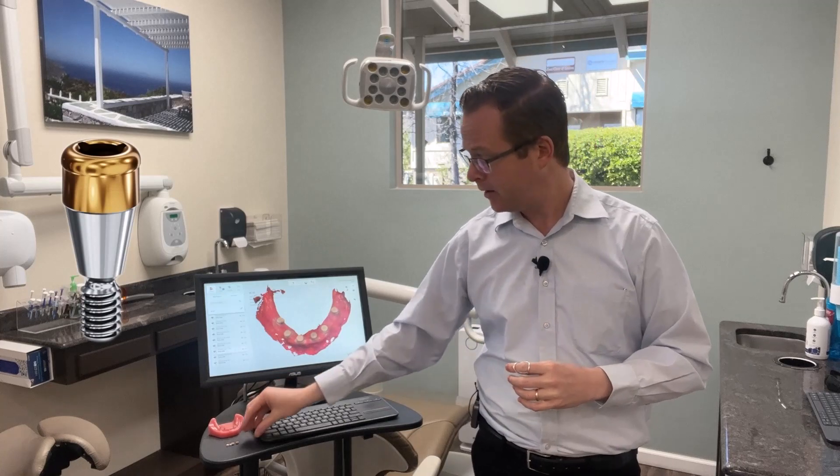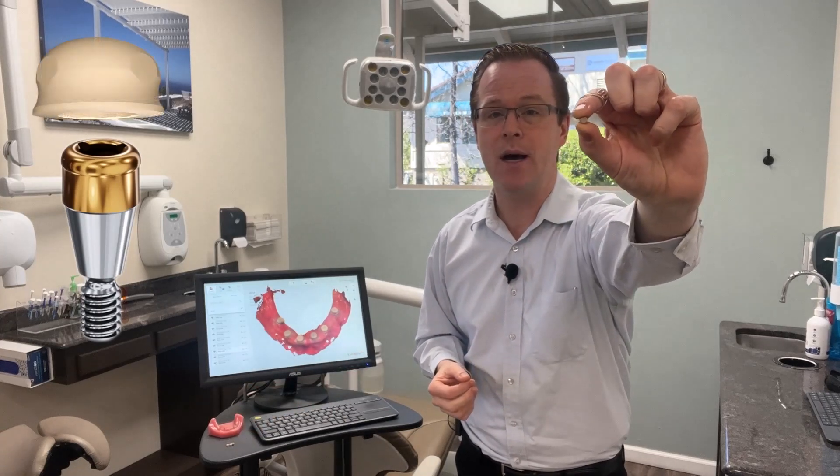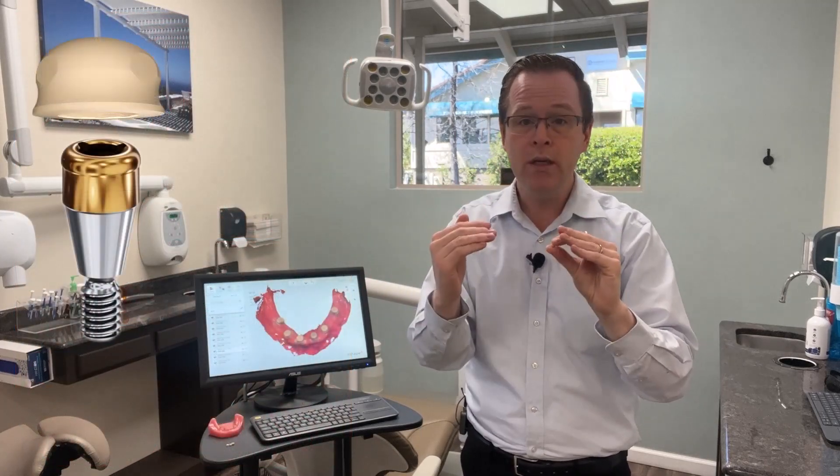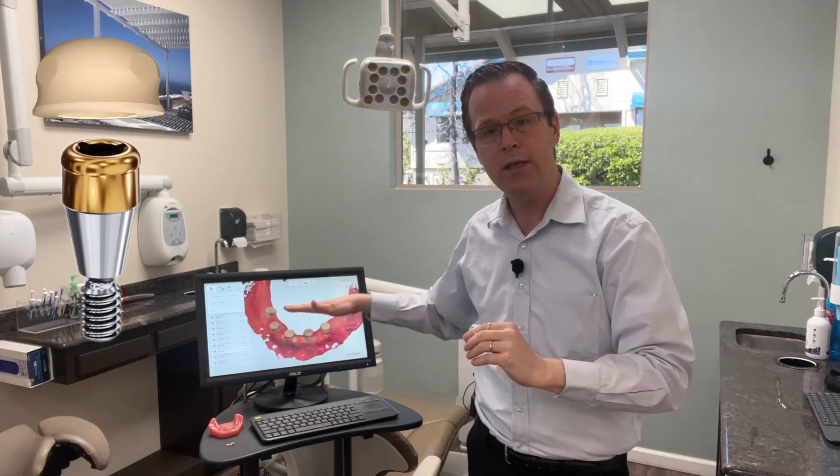In this video, I want to introduce a very simple technique of utilizing your locator abutments to streamline an edentulous scan. Part of that is facilitated by having little scan body markers on the edentulous mandible. By introducing a matte finish coated scan body, it allows my scanner, as it approaches the edentulous ridge, to track the ridge really predictably. The scan body geometry also allows my laboratory to create an ideal recess for a chair-side pickup procedure. When you understand how the locator bounce technique works, you'll be able to implement it right away in your clinical practice.